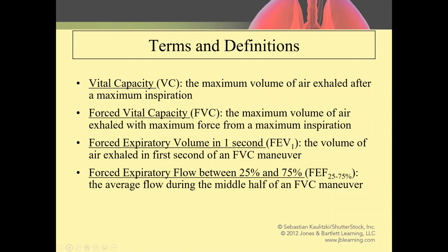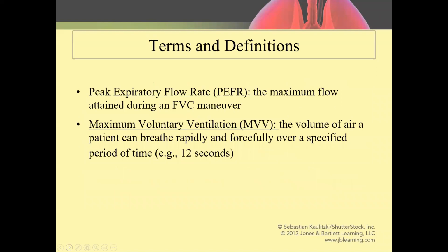Forced expiratory flow between 25 and 75%. The average flow during the middle half of the FVC maneuver can be helpful in diagnosing small airway disease. Other terms, so peak flow, indeed, that's what we may do at the bedside with patients, or train asthmatics to do on their own with a peak flow meter.